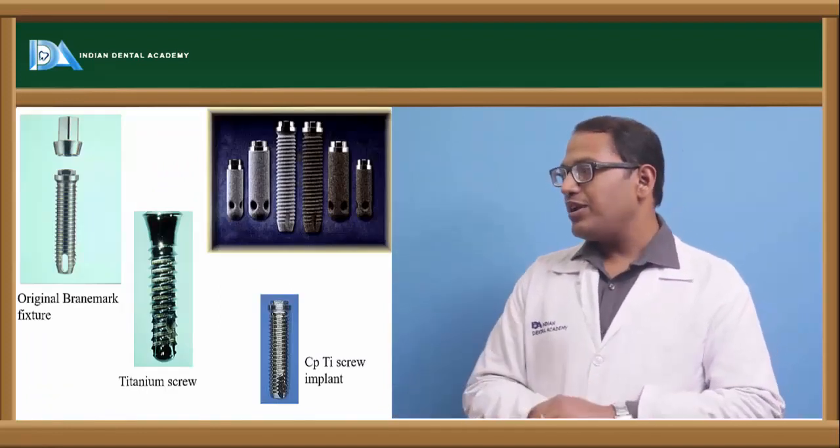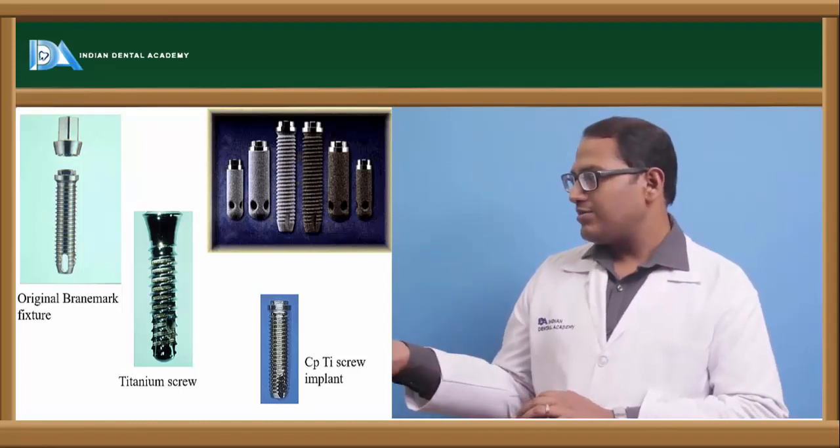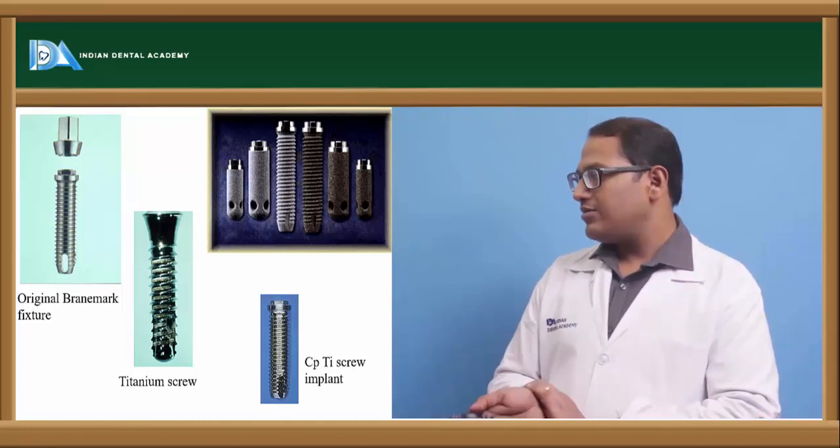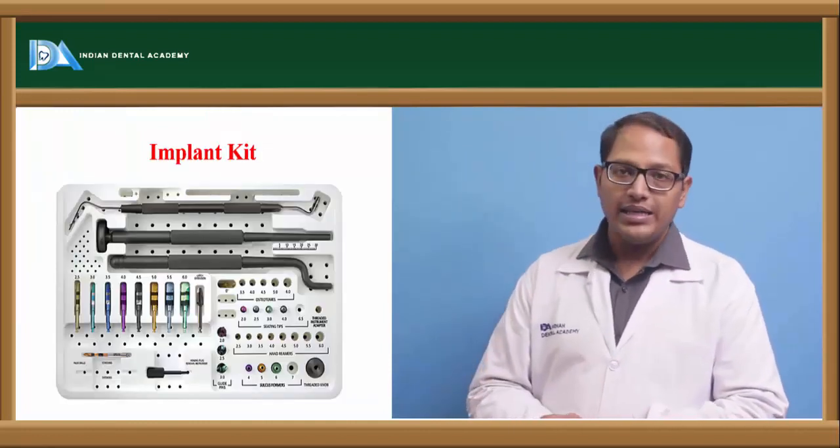These are the original Brånemark fixtures, which you can see, the titanium screws used these days. This is the commercially pure titanium screw implant, and the ones which we use these days. These are the implant kits.